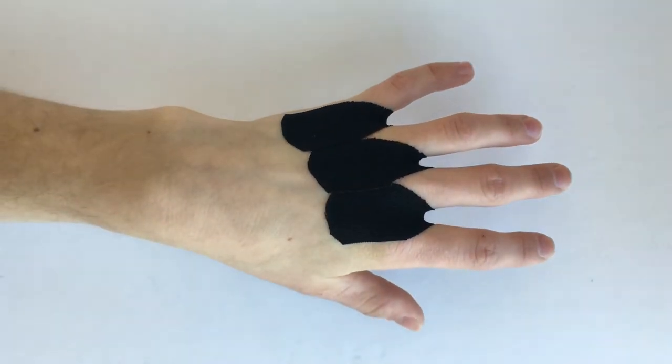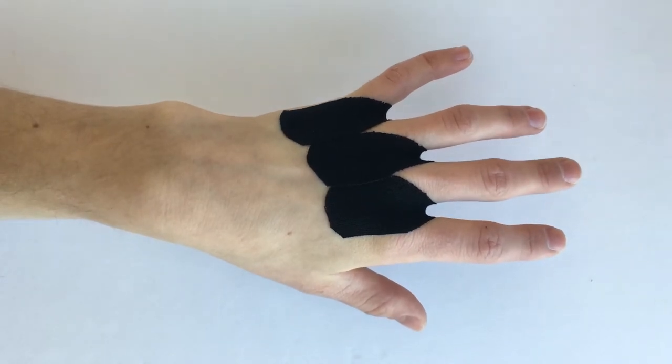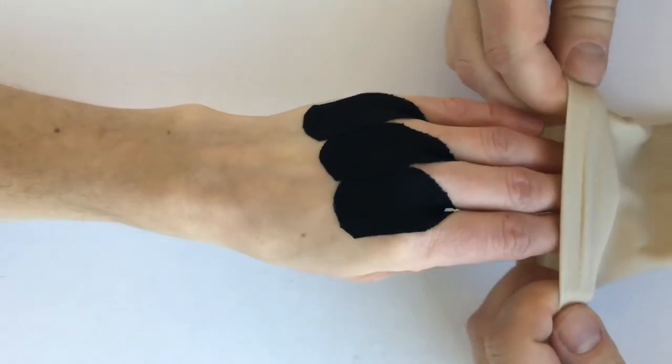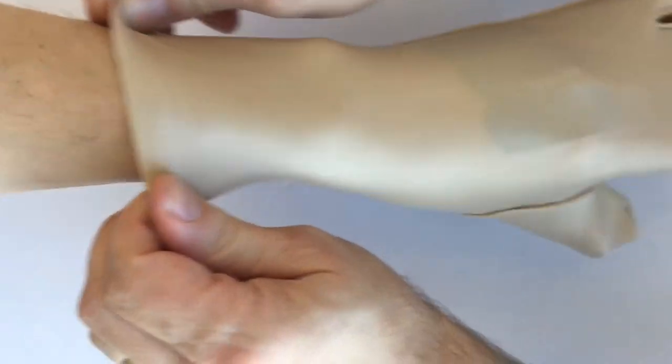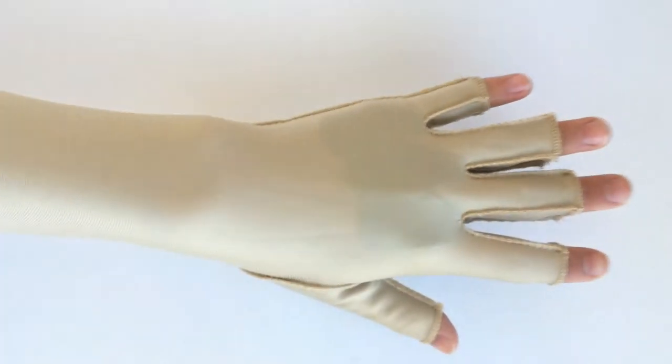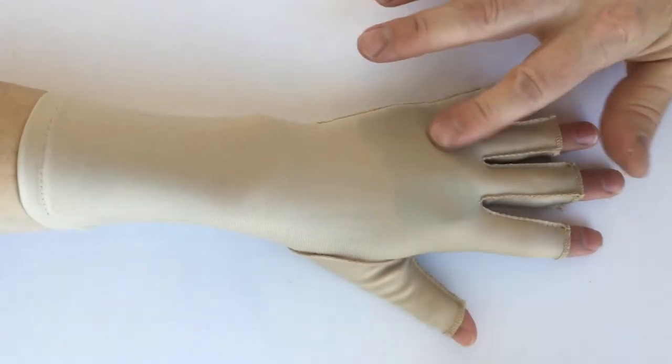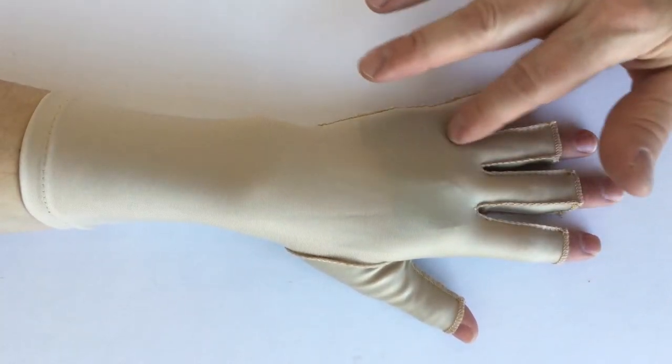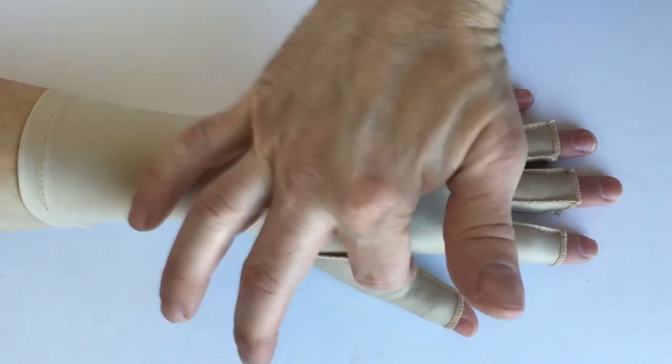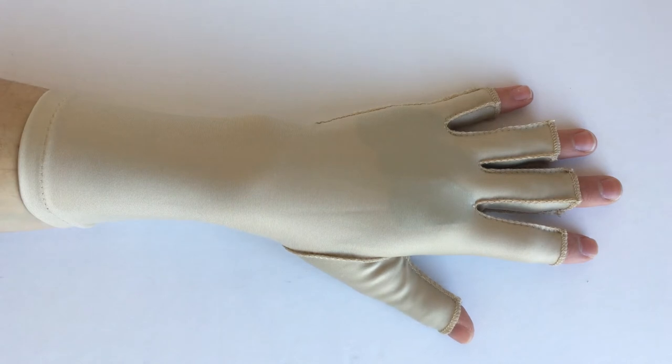Then once you have that done, you can apply your edema glove over top of those. Again, to have just a little bit more compression in each web space. You could also put one in the thumb web if that were beneficial.